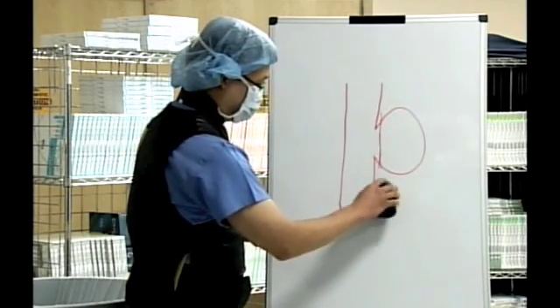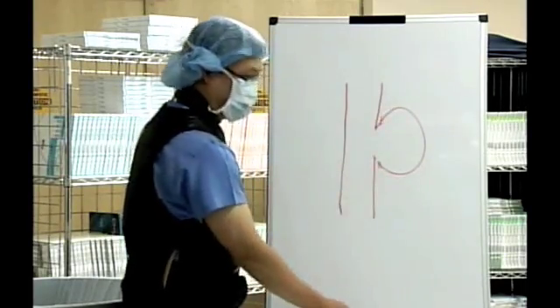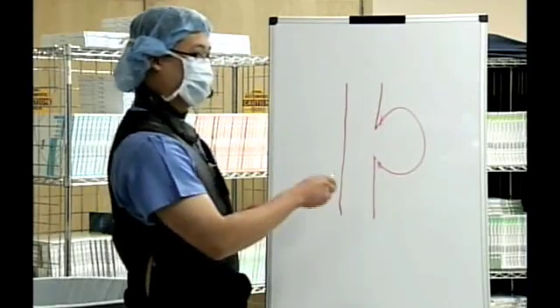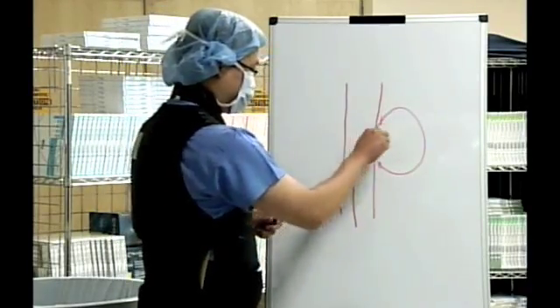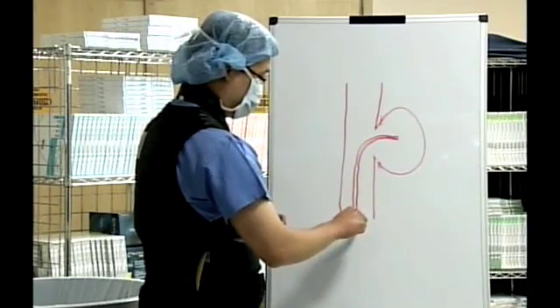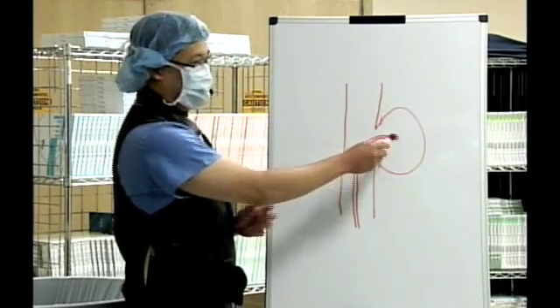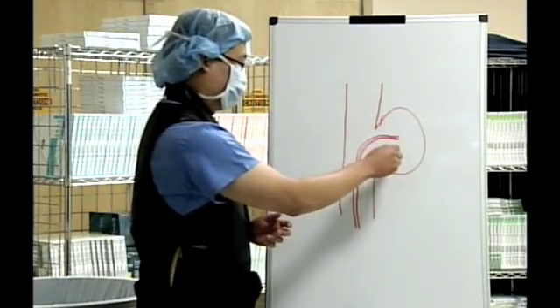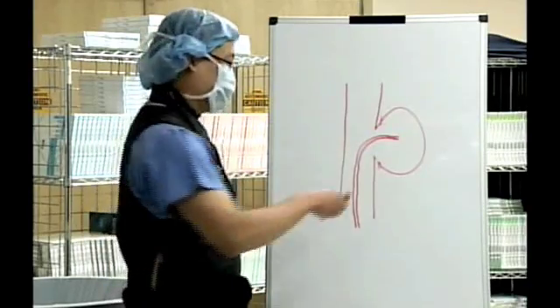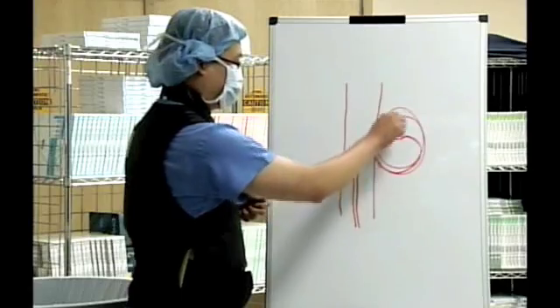Now, what we do in the minimally invasive way is go inside the vessel, a vessel in your leg, and get very, very small catheters up. And a catheter is basically a little small tube here, and you get it very precisely in the aneurysm, and then you can release the coil. That is, you put the coil all the way from the leg, and you feed it all the way up this tiny little catheter, and it comes out the tip, and then you just fill the inside of it.